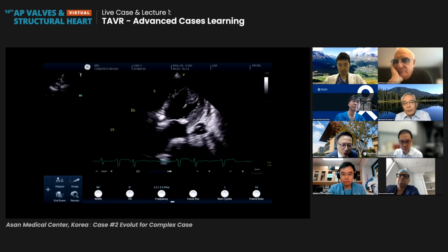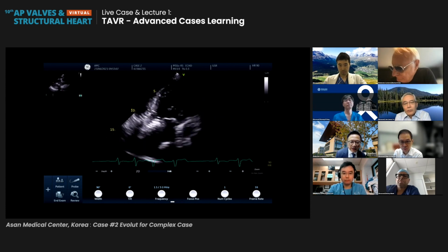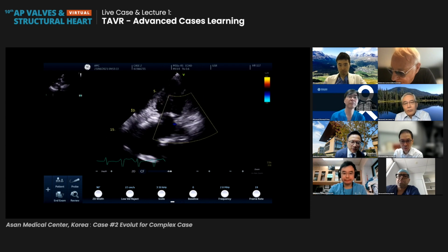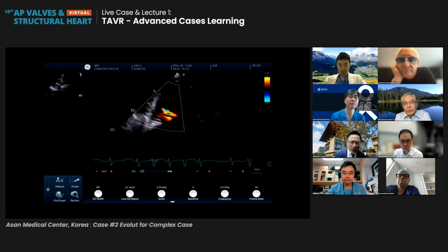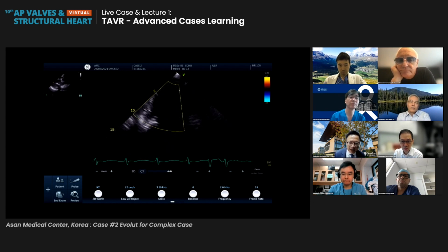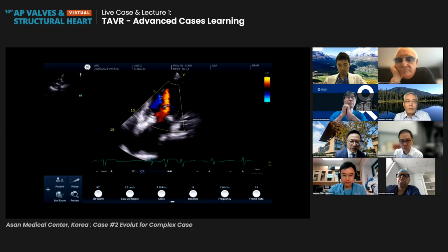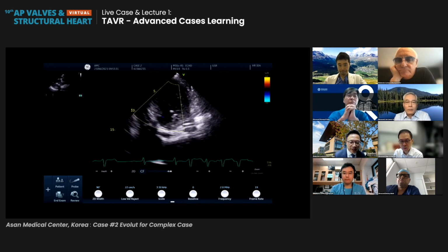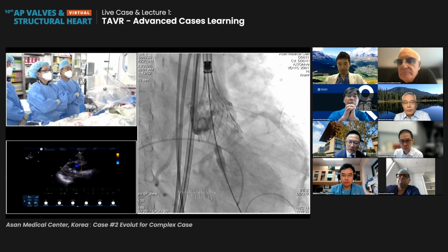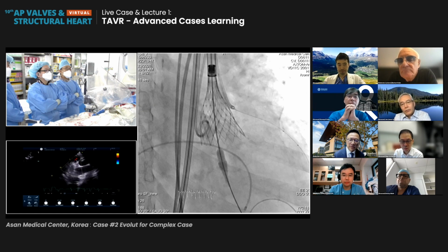I think the left side will pull up once you release it. It will go towards the other side. So it'll probably come up a little bit. It'll probably be okay. It's hard to know for sure the coronary obstruction yet because the valve obviously is not open up that location too much. And I don't recall how thick the left cusp is. It's hard to see on this view, but it doesn't look like there was a lot of calcium, a ball of calcium, which is sometimes a risk that you cannot tell too well, and when it slams up and actually blocks off the left main. So I think the leaflet were not particularly thick or nodular, so that's good. But I think the protection should continue for now.